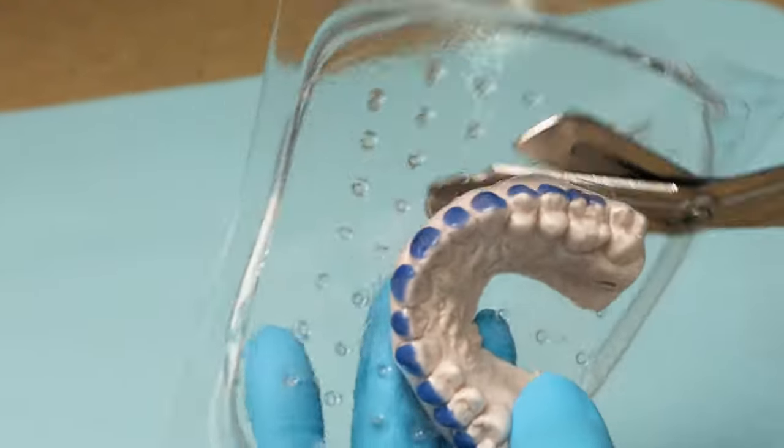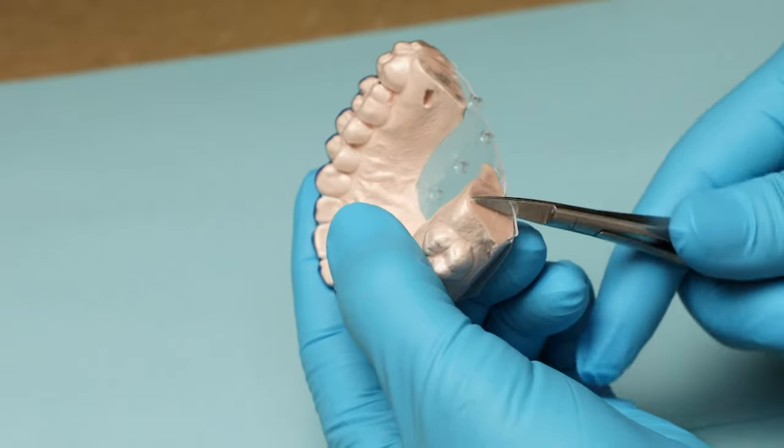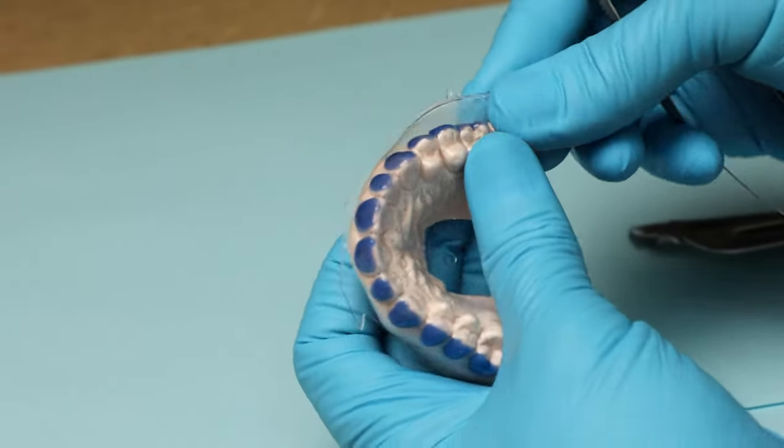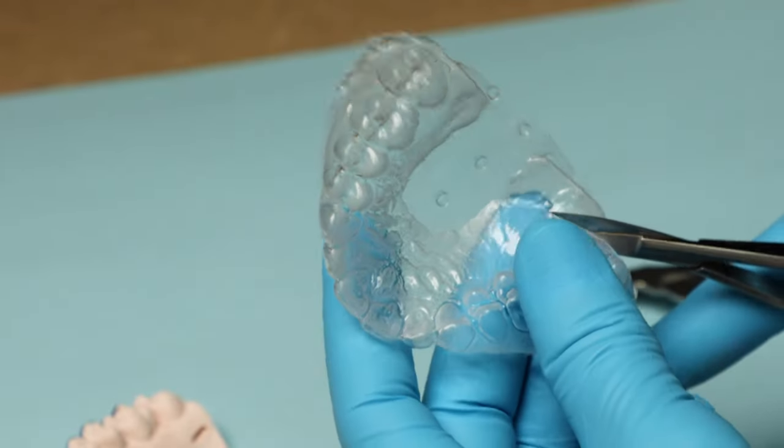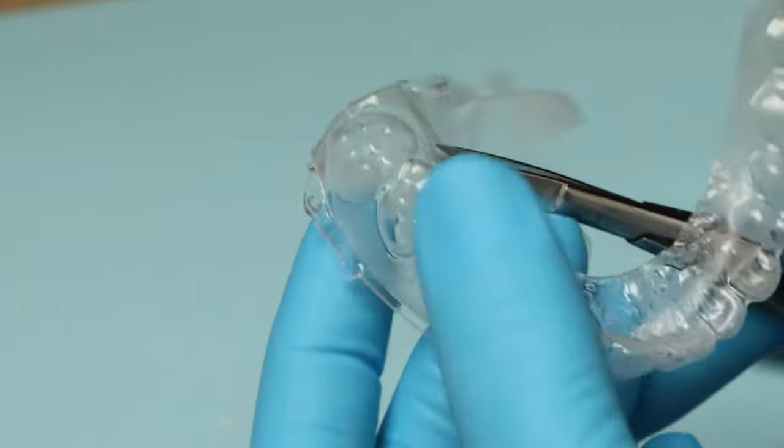Cut away the excess material with Ultradent Utility vinyl cutters. Use ultra-trim scalloping scissors to carefully and precisely trim the tray to the clear line which is at the gingival height, flaming edges to reduce to desired height.